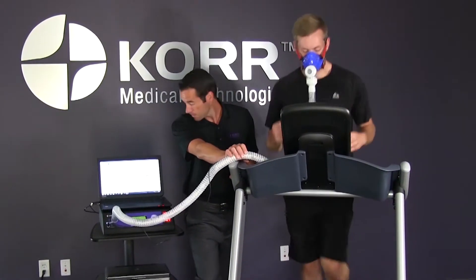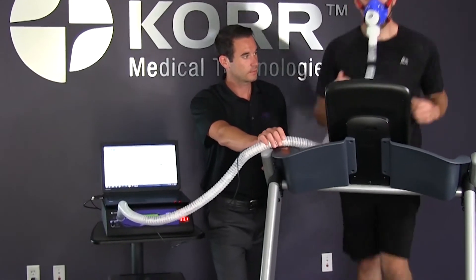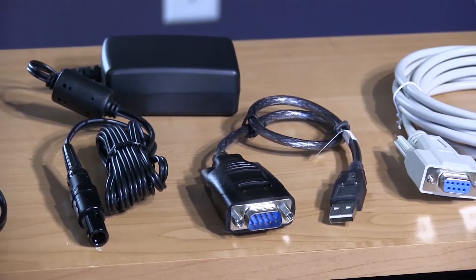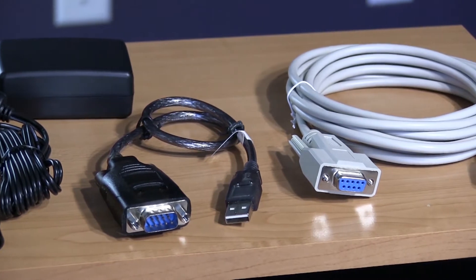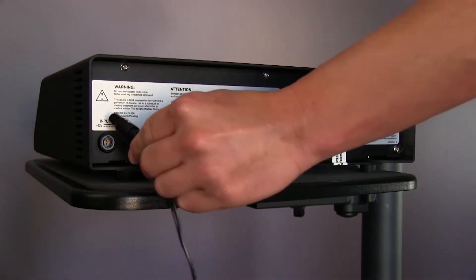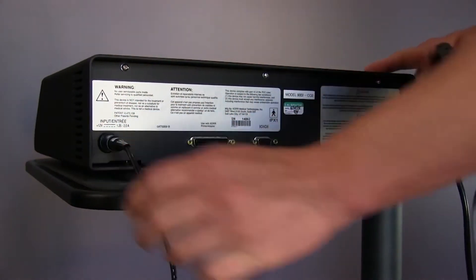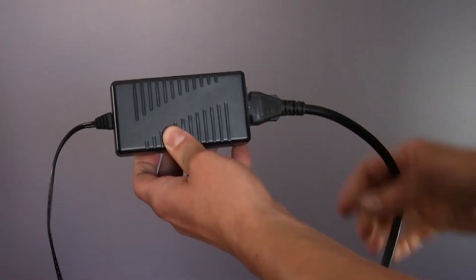Before we start testing, let's walk through setting up your CardioCoach unit with your laptop. Start by locating the CardioCoach AC power supply, power cable, 9-pin serial cable, and the USB converter located in a white box. Take the round end of the AC power supply and insert it into the power port located on the back of the CardioCoach. Connect the power cable to the AC power supply and plug it into the wall.